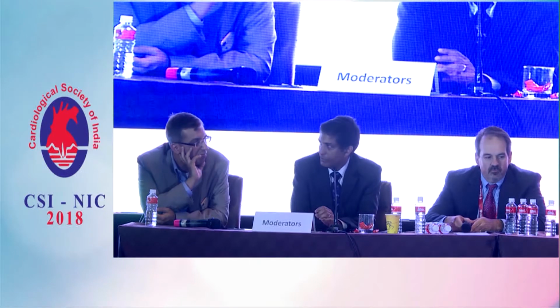So do you use a micropuncture to access? Yes, we do. We use micropuncture for everything. Okay. How about you? Again, I go case by case. If it's a young patient with good access and an easy vessel with a bounding pulse, I probably won't. But if it's any concern, then I'll use micropuncture and ultrasound.